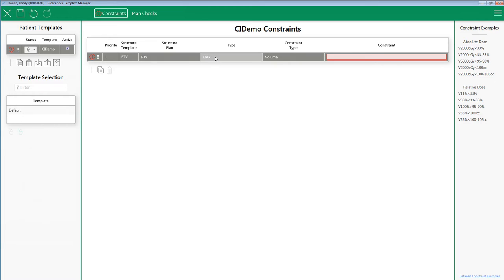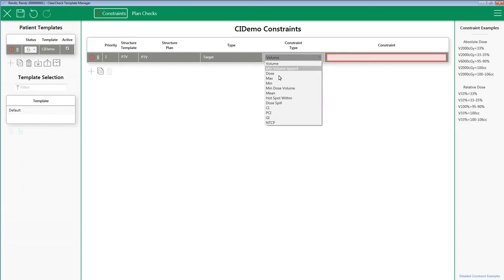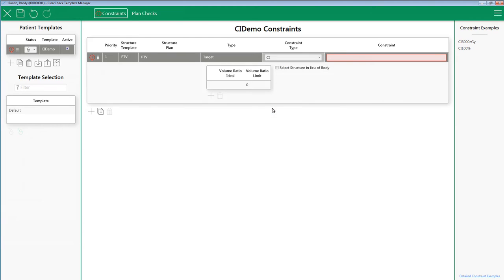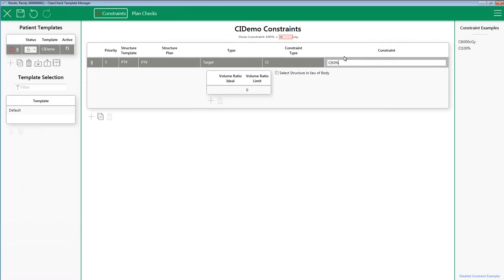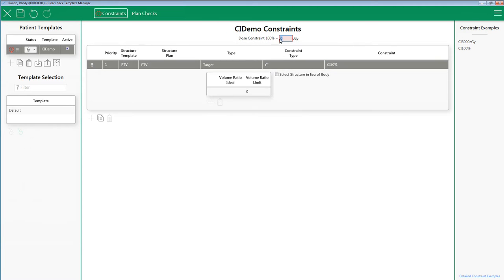Next, for Type, I am going to select Target. And for Constraint Type, I am going to select CI. For the Constraint Shorthand Nomenclature, start with CI. Then simply type the isodose line you would like to use for your ratio. In this example, I am going to do a conformity index on the 50% isodose line. Please note, ClearCheck allows you to pick which isodose line you would like to do a conformity index on.